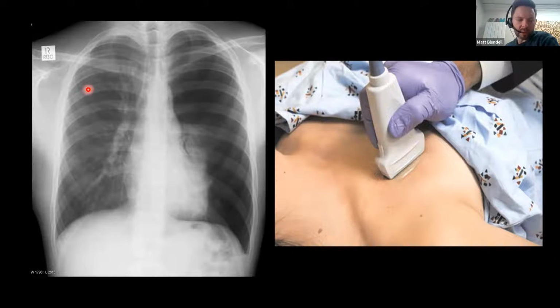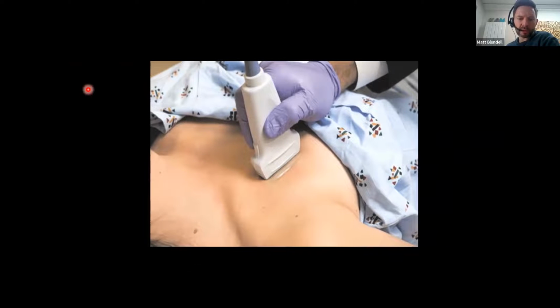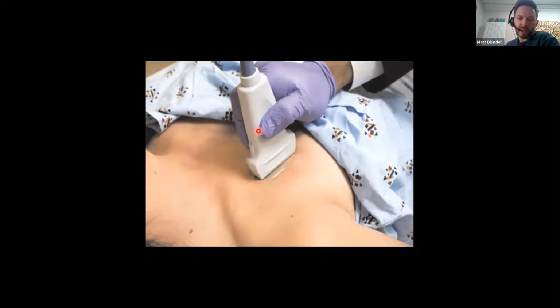These patients often would go and have a CT. But again, we can use ultrasound instead of a CT to help diagnose this. So if you're going to use ultrasound to look for pneumothorax, I generally use the higher resolution probe, because we're only looking at the pleura, which is probably only a couple of centimeters beneath the skin. And I normally lie the patient flat as well. So air from a pneumothorax is going to rise to the highest point. So generally, if you have a patient lying flat, it's going to be around the 3rd or 4th rib space.